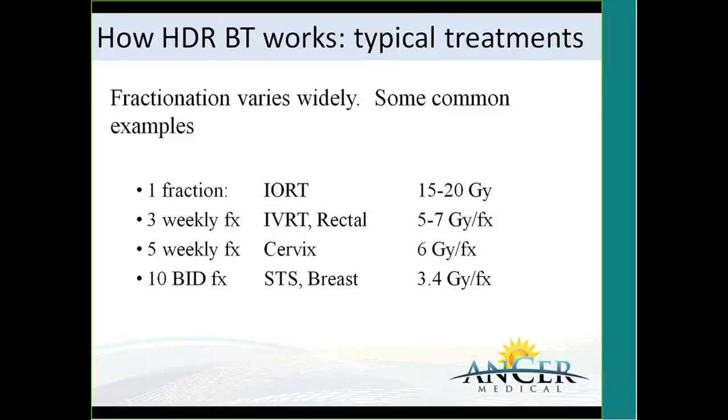Okay, gotcha. But these sources through the catheters are generally placed inside the tumor and not around the outside necessarily? That depends on the geometry. For example, the prostate is your target volume, and there are foci of tumors inside the prostate that you want to treat. So we are treating the whole prostate, and the catheters are inserted inside the prostate.